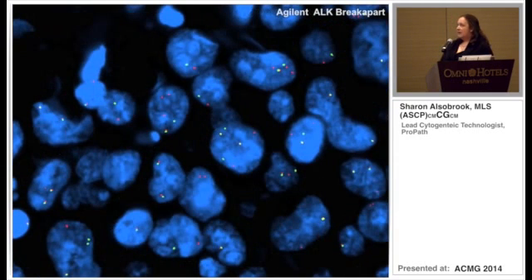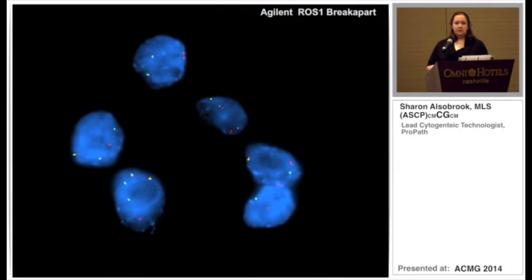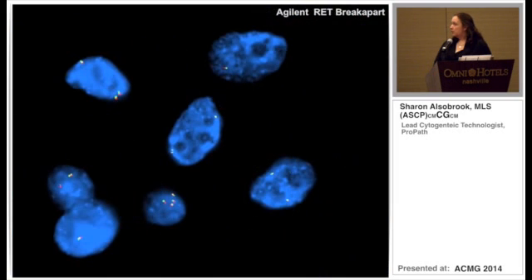This is an ALK. This is an abnormal ALK. That's why you see fusions and break-aparts of the probe with red and green individual signals. This is a known positive. Also, ROS1, which is becoming more and more relevant in lung cancers, and RET also. This is a break-apart probe as well, and this one is negative.